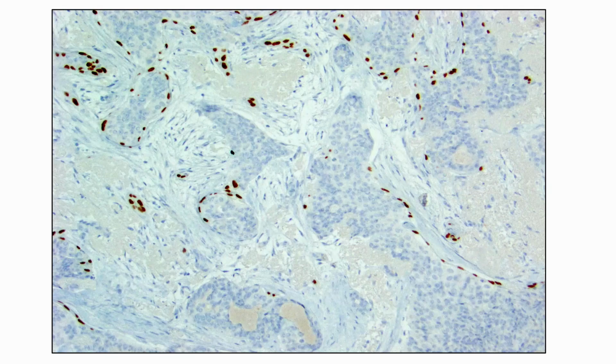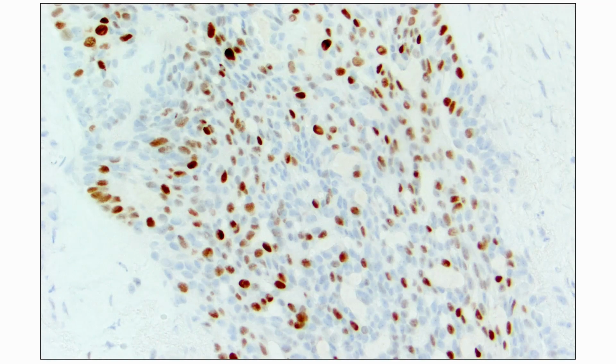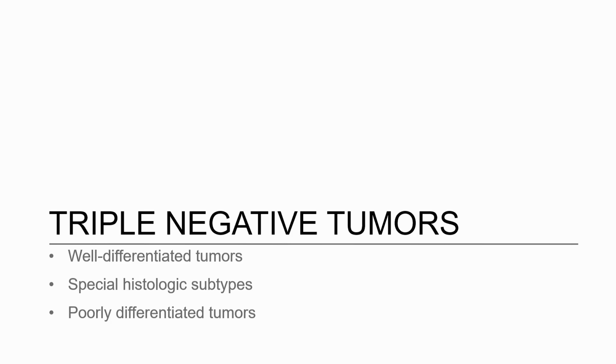The original pathologist did a P63 stain, and unfortunately still somehow interpreted this as invasive. You need to remember that P63 is a nuclear stain, so you're going to have loss or absence of nuclei in your plane of section in some areas. The saving grace should have been the ER stain. This shows heterogeneous expression, which is more in keeping with usual ductal hyperplasia. So that can be a useful safety check.